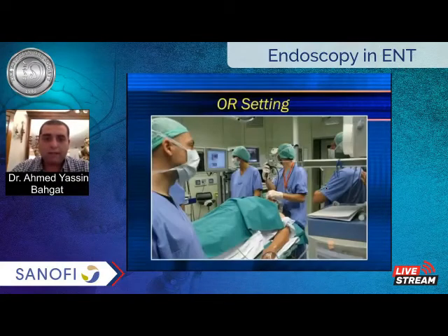Here is the OR setting. This is the patient like that. On his right is the anesthesia. At the head of the patient, we usually stand.